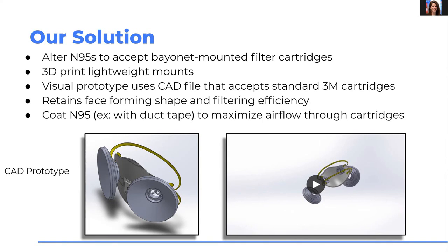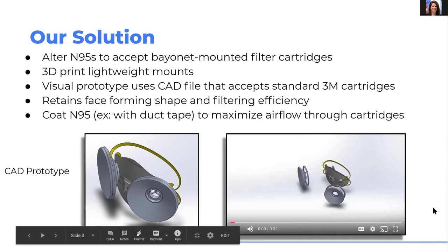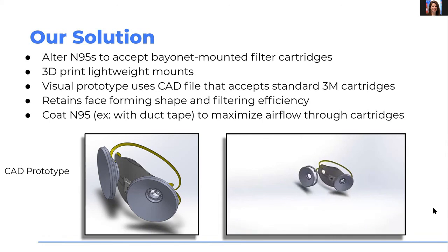I have a question about it. With cutting the holes in it, would there be a proposed method of doing that, or would anyone with just scissors or something cut a hole into this? Let's say you're on a nursing unit and you are working with a patient and you need to reuse this now. What tools would you use to actually make those holes? A hole punch would be ideal, of course, but you could probably do it with scissors. And there's going to be a seal there, and there'll be more than enough overlap to deal with the imprecision that's involved with cutting a hole with scissors.